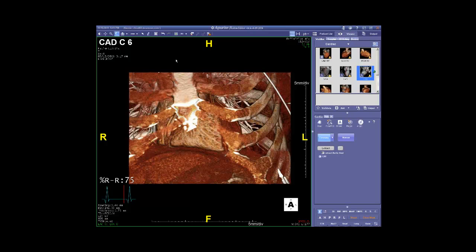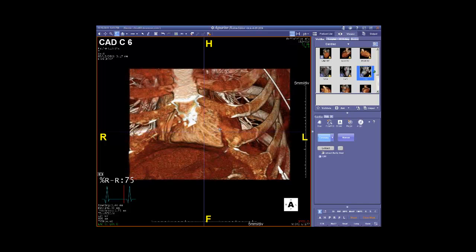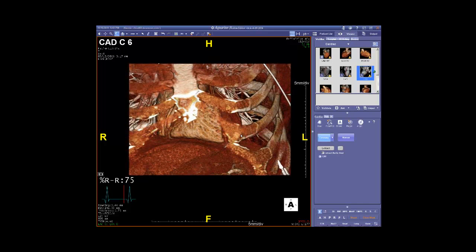We'll start with our first case. These are bread-and-butter cases we're reviewing today, actually out of our clinic — real patients that we've taken care of where CT angiography has been helpful in the diagnosis.